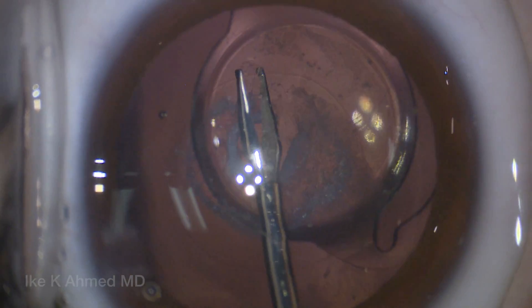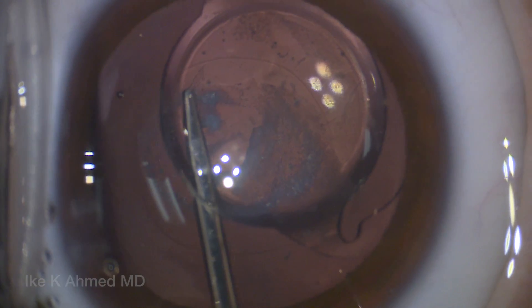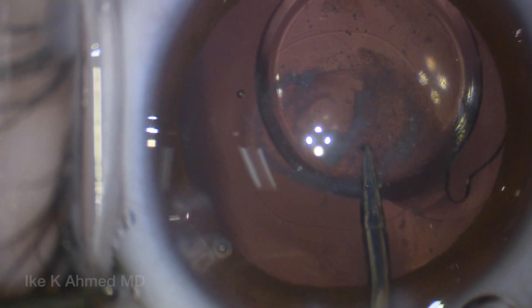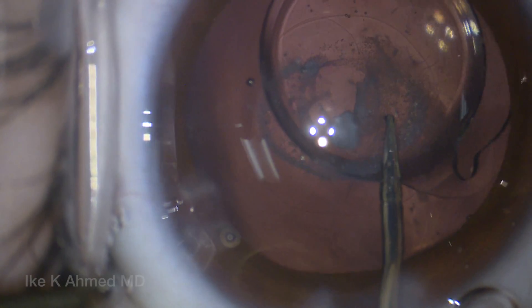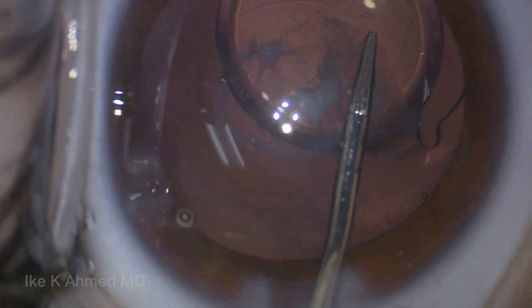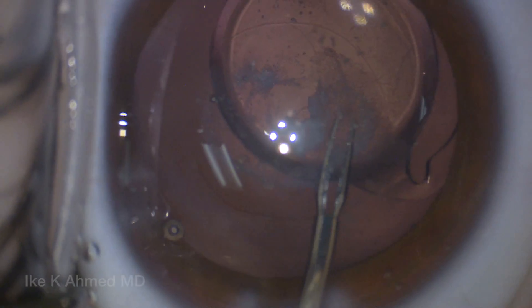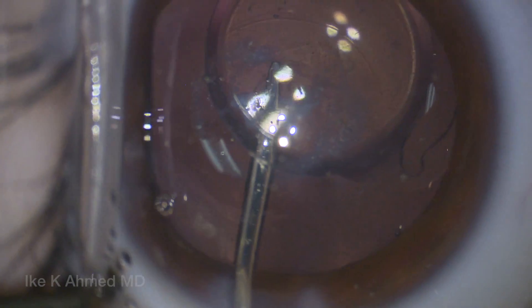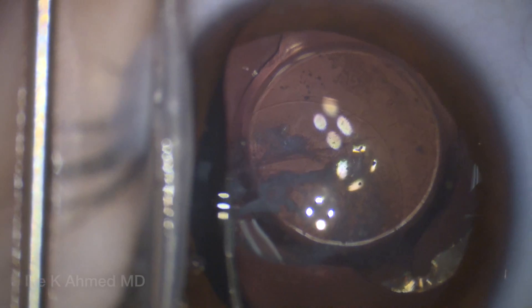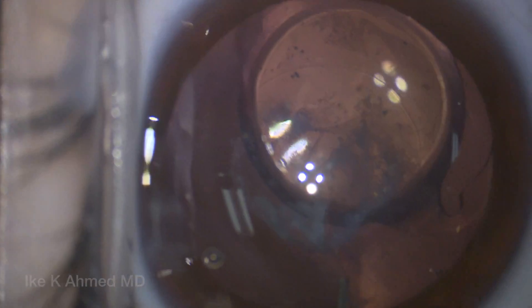We'll then perform a posterior capsular rhexis. This is important because it's unlikely that a YAG laser will be sufficient to remove the visual axis opacification here. We'll proceed to do this careful capsular rhexis, aiming for about a 4.5 to 5 mm capsular opening posteriorly. This may be handy to do a posterior optic buttonhole to place the IOL in a centered position and prevent vitreous prolapse anteriorly. Using a micro forceps facilitates performance of this capsular rhexis in a curvilinear fashion.